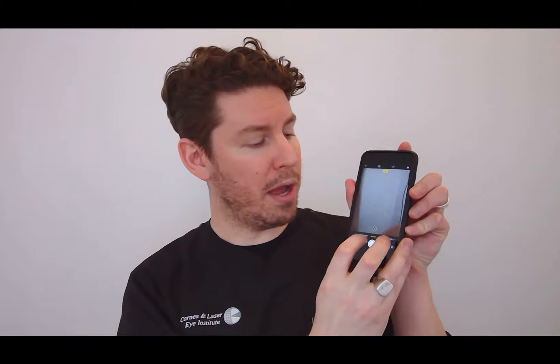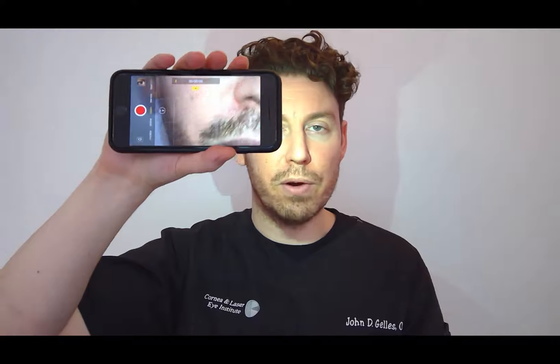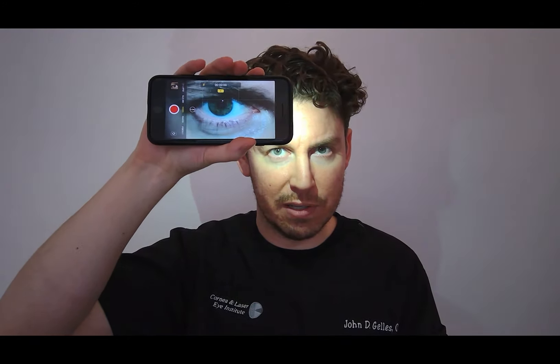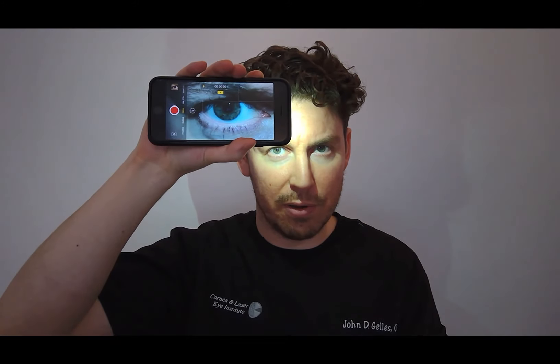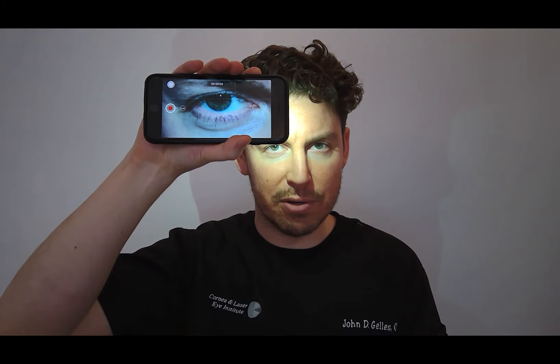To take a video, it's very much the same process. You're going to go ahead and open up your camera app, go to the video mode, and then turn your flash on, and then bring your zoom into the range of 2 to 2.5. Once you have that achieved, looking at the reflection of your display in the mirror, you want to make sure that your eye is aligned and in frame, then go ahead and start the capture. At that point, you're going to go ahead and do what your doctor has directed.